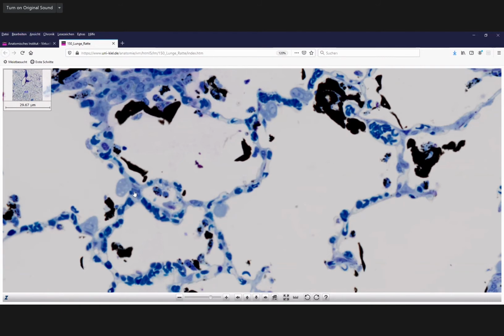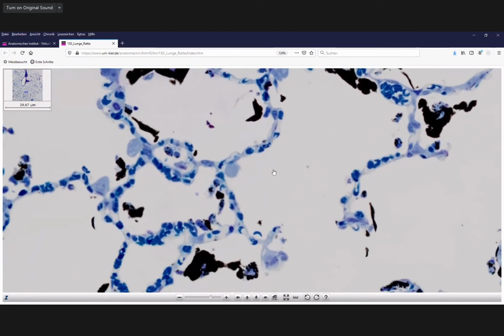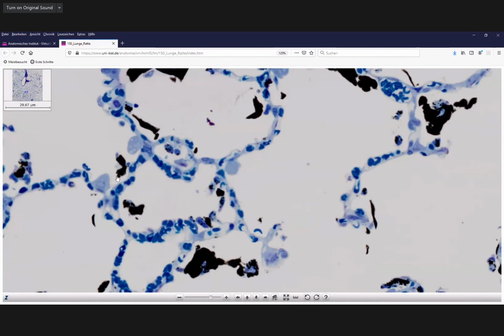They are big, they are bulging forward, they are not squamous, and they have these storage vesicles, which you can see even in a normal light microscope quite easily. Okay. And one major job is to produce surfactant, and the other major job, you have not named that yet. What are type 2 cells also doing?